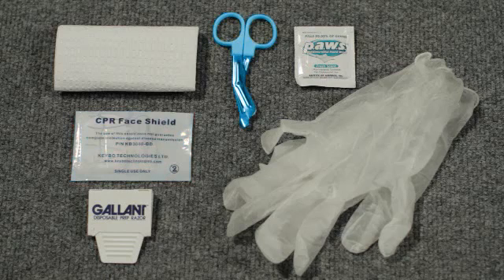a small pair of scissors for cutting clothing if necessary, a moist towelette for cleaning up, a razor for shaving any chest hair, a paper towel for drying the victim's skin, and a pair of non-latex gloves to protect your hands. In a real rescue, of course, you would use all these items if needed. For training purposes, we won't use them in this exercise.